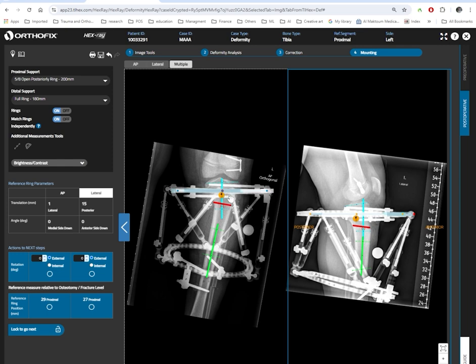So it's 0, 0. Suppose this tab, which is between the first and the second, was here. We have to rotate this to here. Let me show you what I mean. If I do this one, see this red dot has rotated externally. If my master tab, which is between the first and the second strut, was here, I would have to rotate it. But luckily I got it spot on. I don't need to do that.